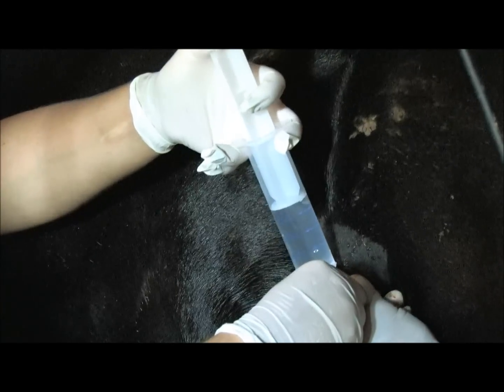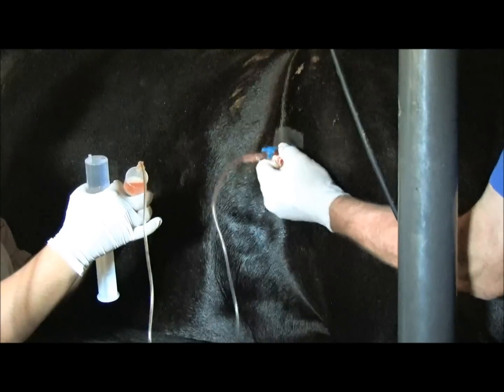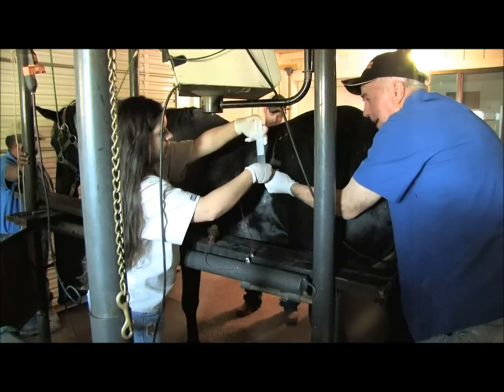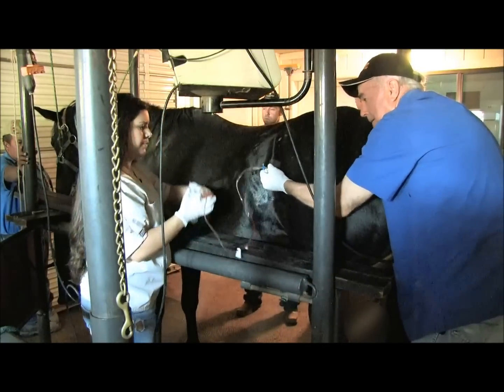The needle is connected to an aspiration syringe by tubing, and flush media is injected into the follicle through a three-way stopcock attached to the needle. As you can see, the follicle is filled and aspirated through the syringe. The needle can be manipulated both internally and externally as the entire inside surface area of the follicle is aspirated.